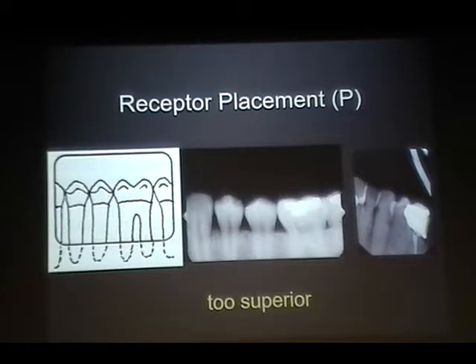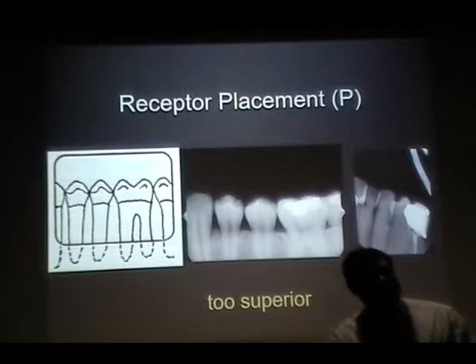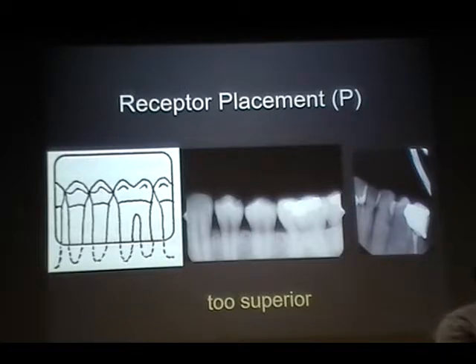So you are wasting so much space here, right? Basically the patient did not bite on the bite block. That's one of the reasons you are only capturing the superior most portion of the teeth, not the inferior most.